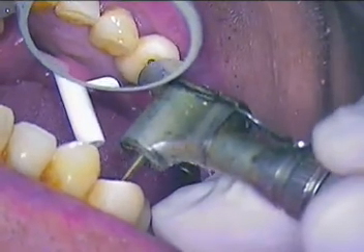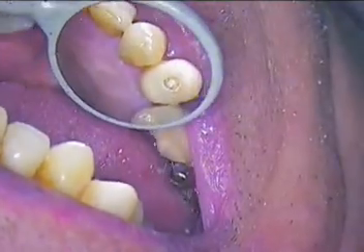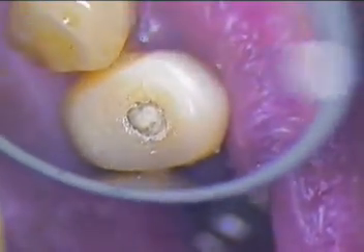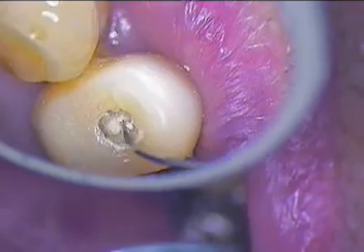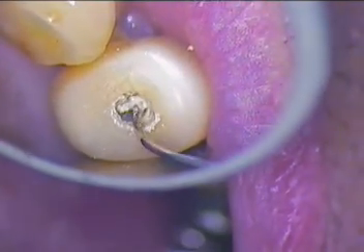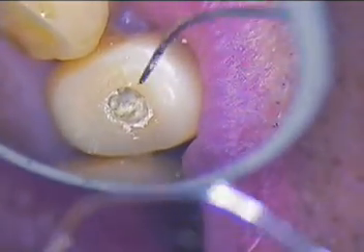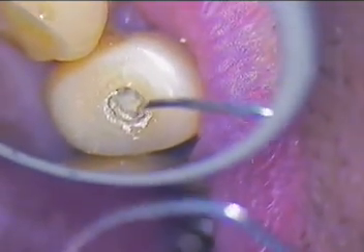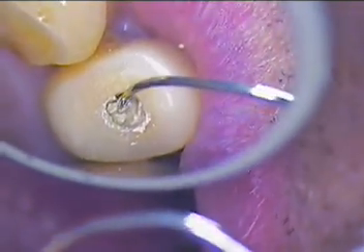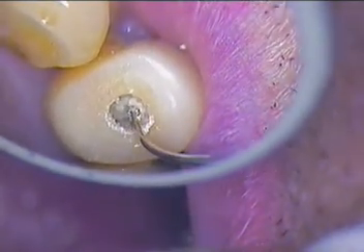Right now I'm going to ask for the long explorer and we'll get that soft piece of cotton out of there. How are you doing, Luigi? Everything good? Luigi is wearing our video eyewear selected for the system, so the patient is able to actually watch everything that you're seeing out there on the video.